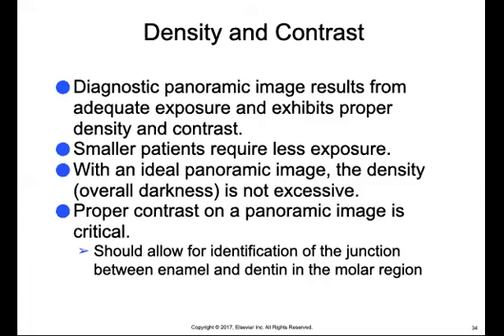And the reason for proper contrast is that with the panoramic X-ray image, the way this image is taken is that we have multiple images that are seen together to form one image. The panoramic unit is designed to blur out the type of overlapping of image that occurs when it tries to seam the images together.